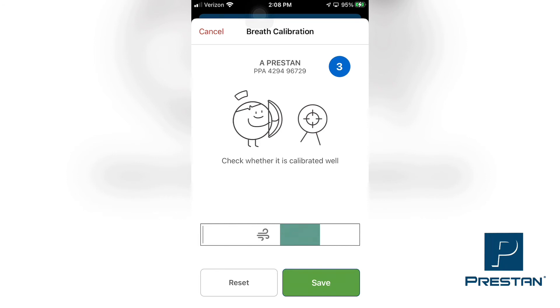Once satisfied that the ventilations are working properly and you have sufficient visual chest rise, tap the Save button to complete the calibration.